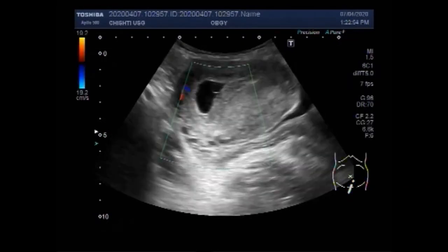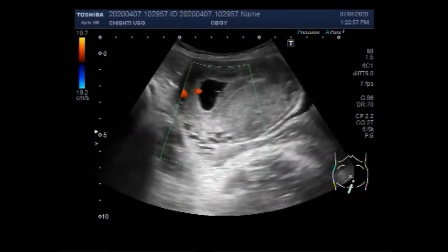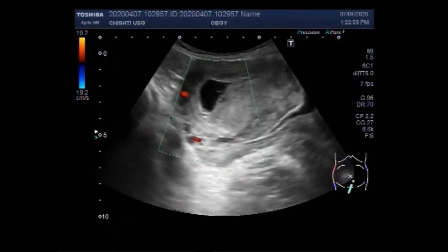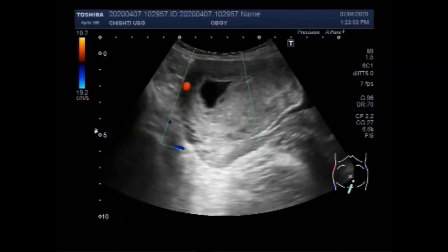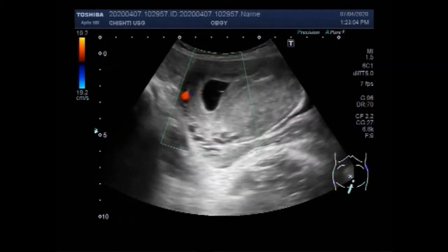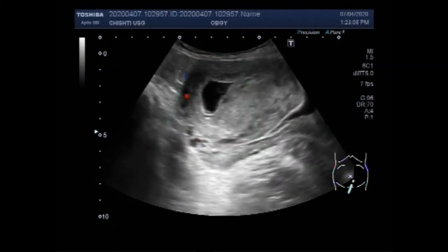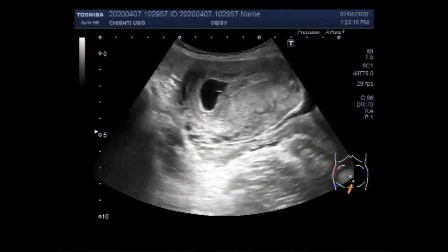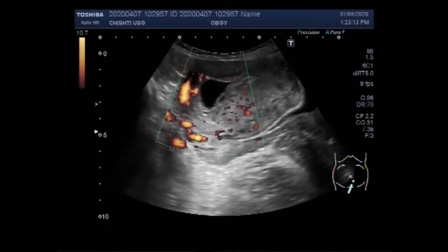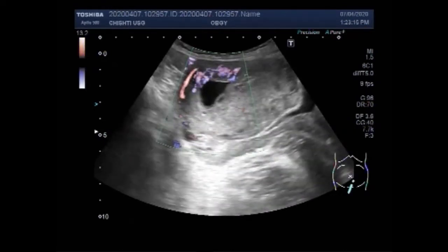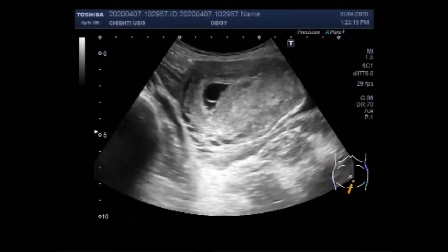During early embryogenesis, the gestational sac consists of extra-embryonic coelom, also called the chorionic cavity. The gestation sac is normally contained within the uterus. One of the more common types of miscarriages is known as anembryonic pregnancy, with an empty gestation sac.